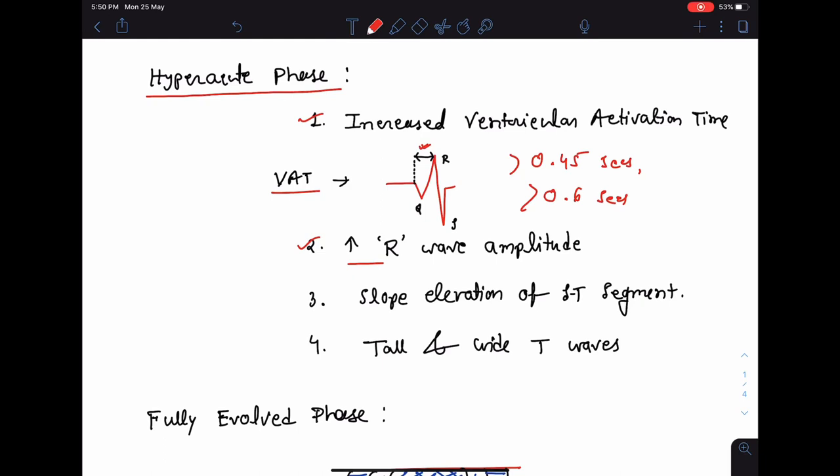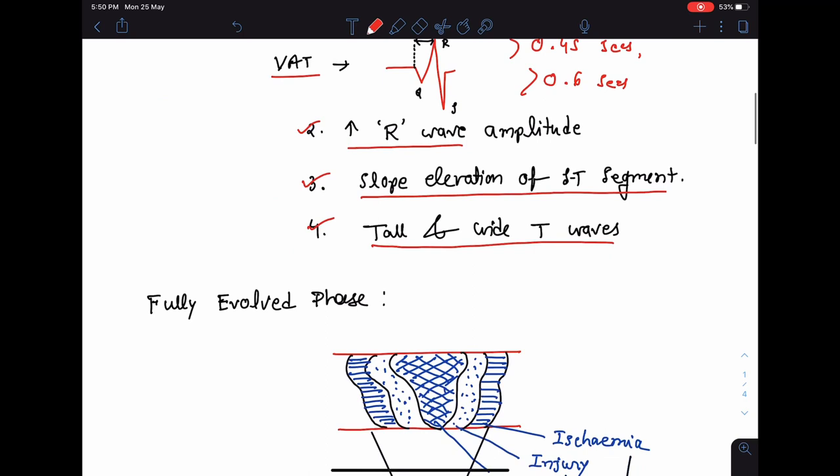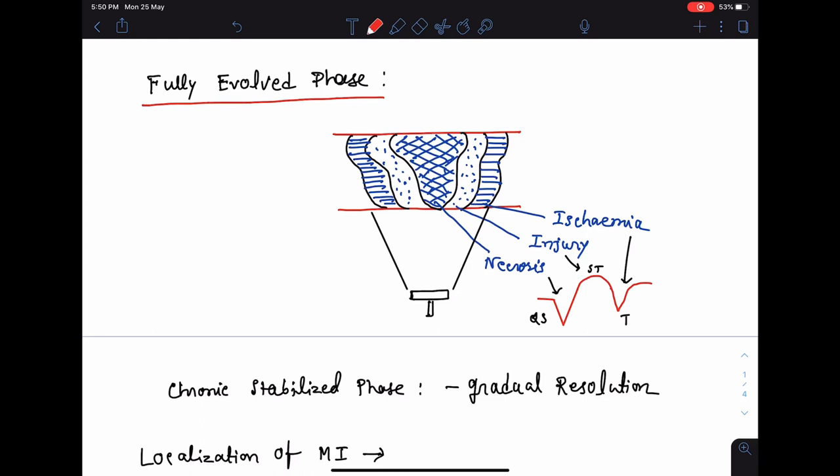The next change in the hyper acute phase will be an increase in R wave amplitude, followed by a slope elevation of the ST segment, and lastly there will be tall and wide T waves. The next stage is the fully evolved phase.